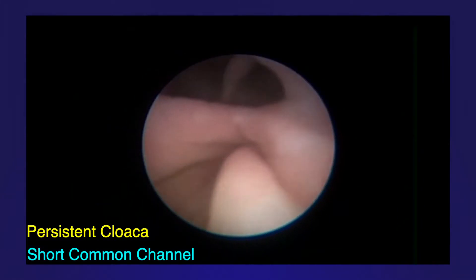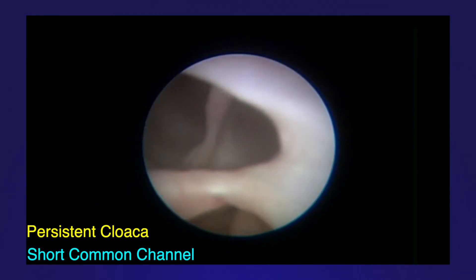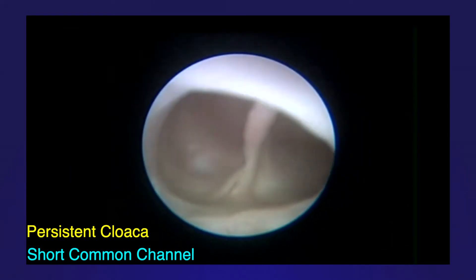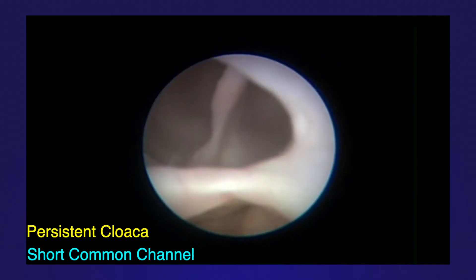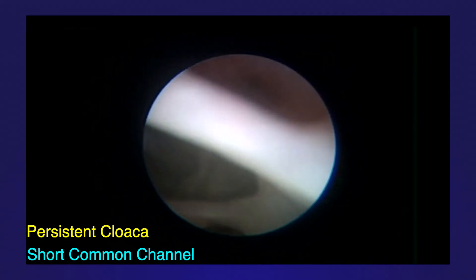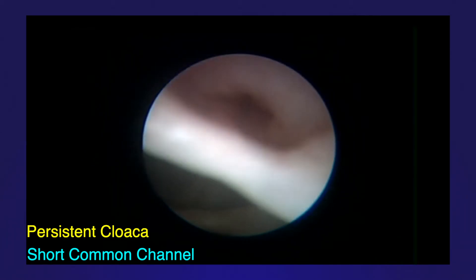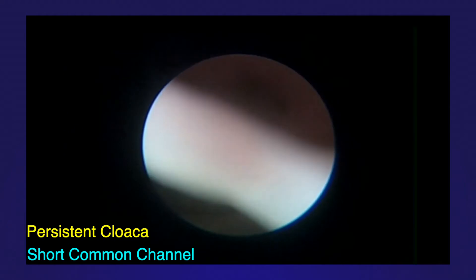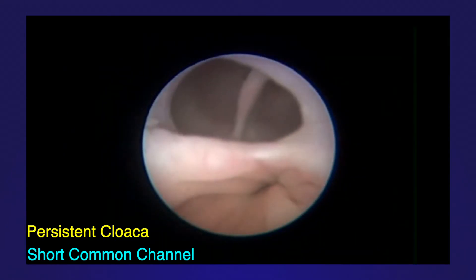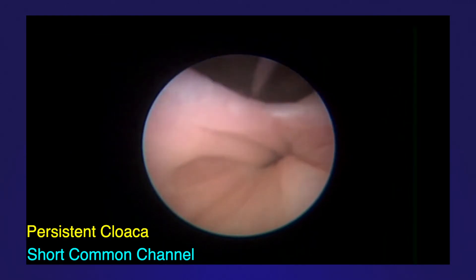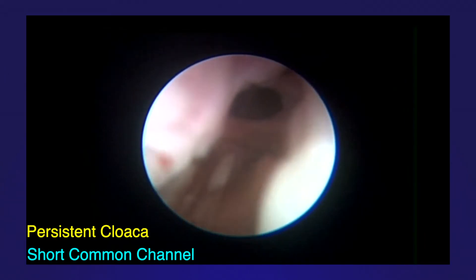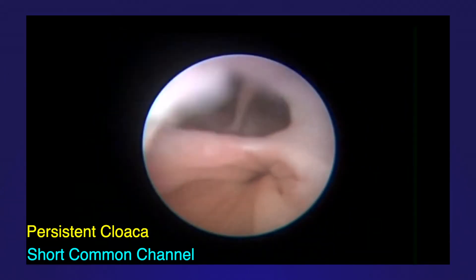In this case, a short common channel was clearly identified. All three orifices — urethra, vagina, and rectum — are identified within a short distance of the perineum. This view shows a junction of the urethral and vaginal orifices. A longitudinal septum resulting in two hemivaginas is identified, as is commonly seen in persistent cloaca.